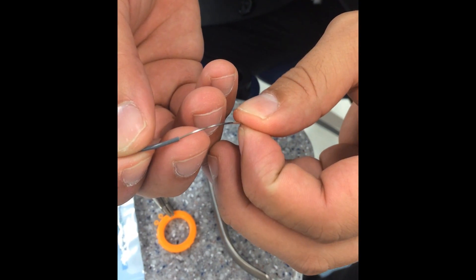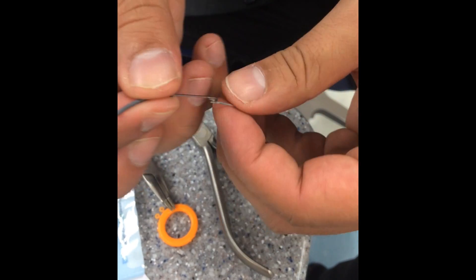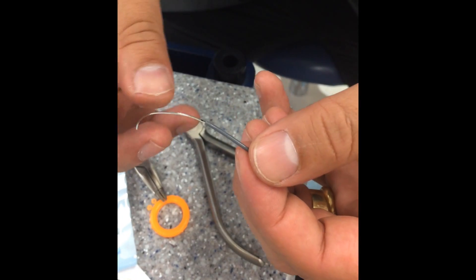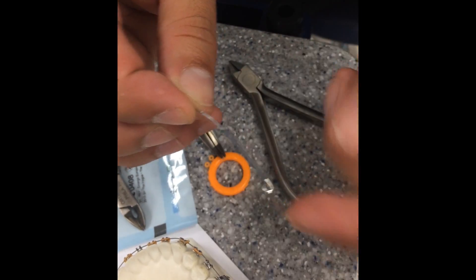You're saying you can use tubing or closed coil. I'd rather... You like the tubing more, though? No, but thinking it through — the closed coil might be better because of the hygiene. It doesn't have to be all the way; you can leave it a little bit here.